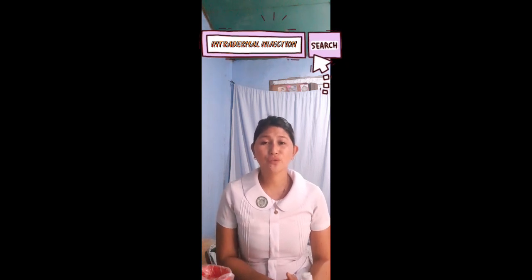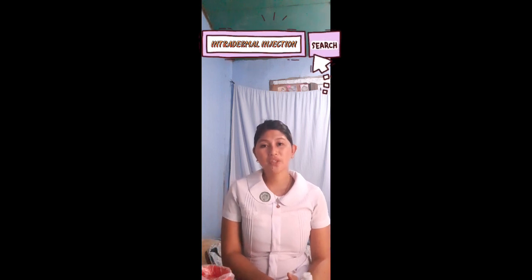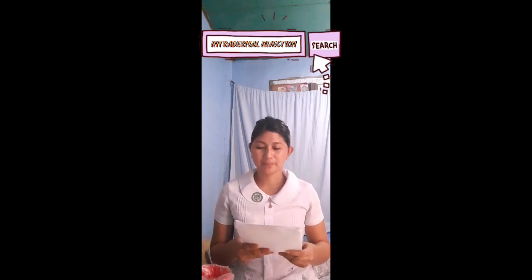It is important to observe the rights of drug medication administration to ensure that we are giving the safest care. Prior to the conduct of the procedure, the first thing to do is to check the doctor's order on the patient medication record. So first, I am going to check the medication that we are giving to the patient. So here is the record of the patient.